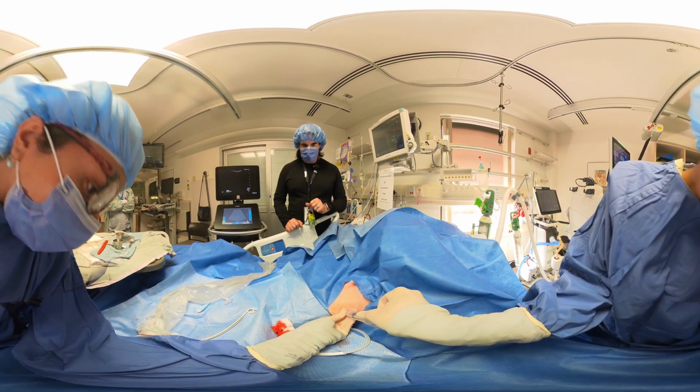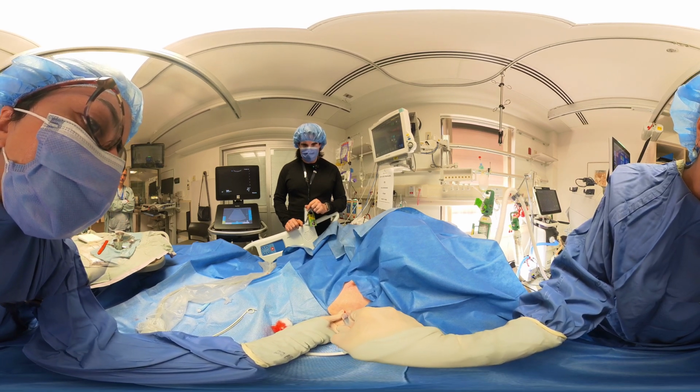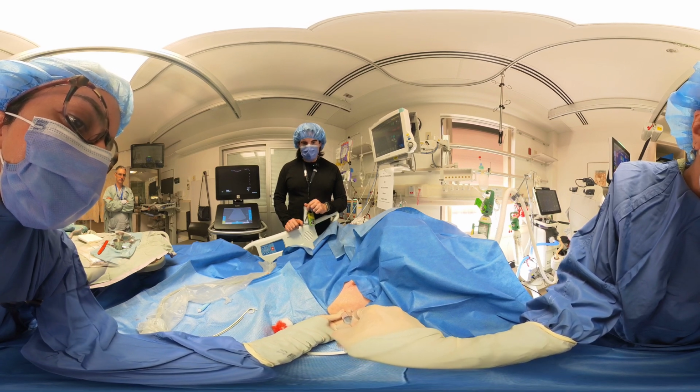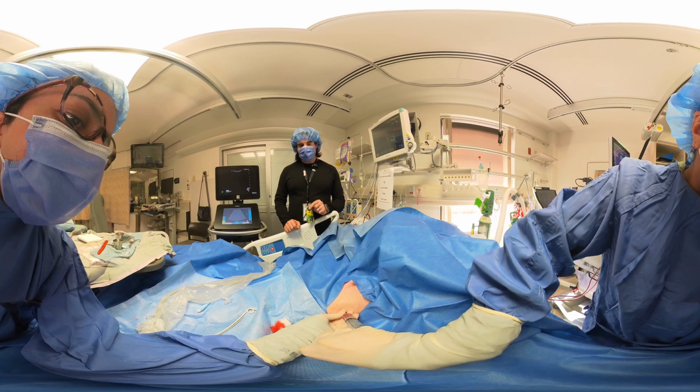Am I getting that? Yeah, you're getting some. I can see it there. There you go. I think it's coming now. Okay, so from here you will detach the syringe.